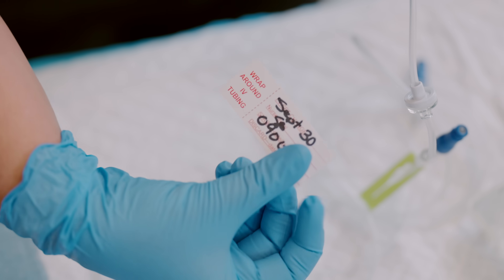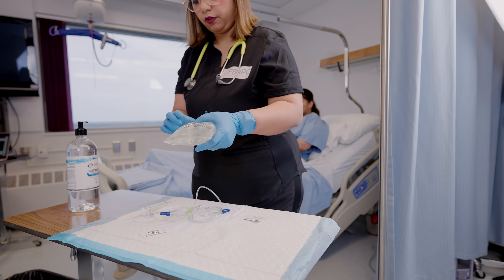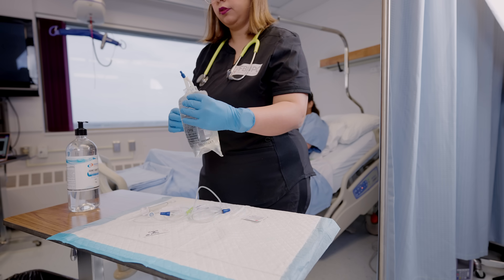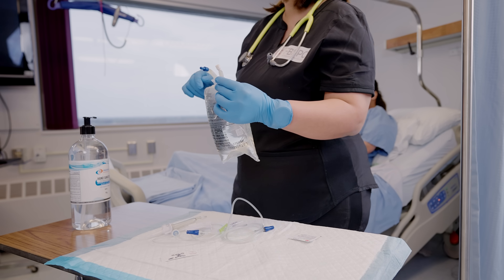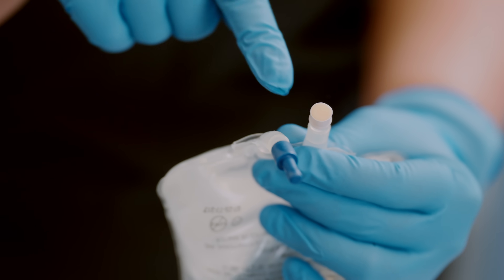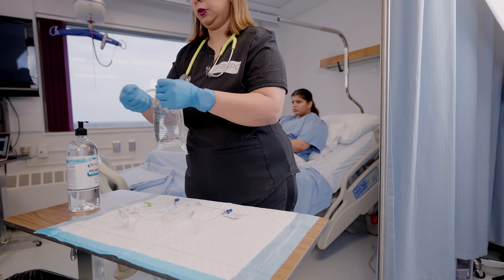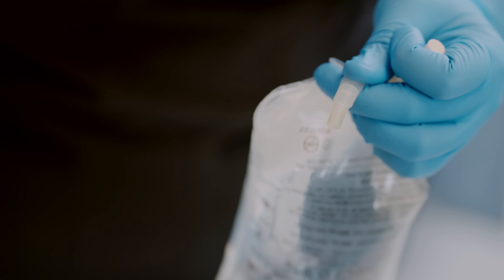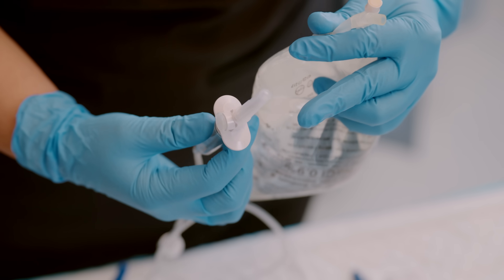Date and time the tubing so you don't forget later. Open the IV bag packaging and hold the IV bag in your non-dominant hand upside down — you will see two ports on the bag. The medication port is one you won't be using, and then you will see the spiking port. Pull the stopper off the spiking port and always keep the port opening sterile — don't touch it.